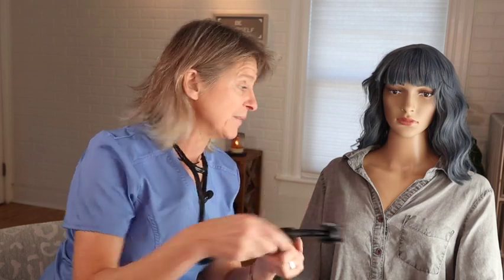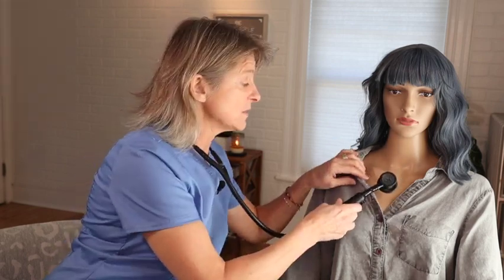With my stethoscope, I'm going to use the diaphragm for most of my sounds. There is one that I'm going to turn and use the bell, but I invite you to try both of them because you may find that you hear better with one or the other. So I would suggest playing around with which one you want to use. For myself, I've been using the diaphragm for most of my heart sounds.